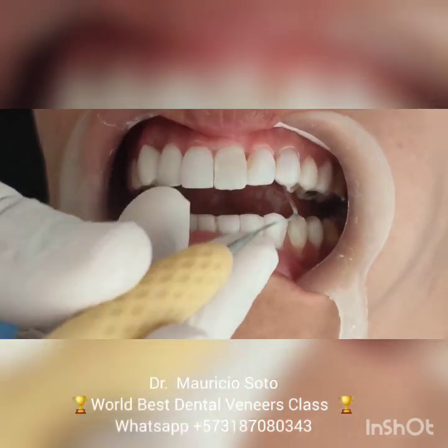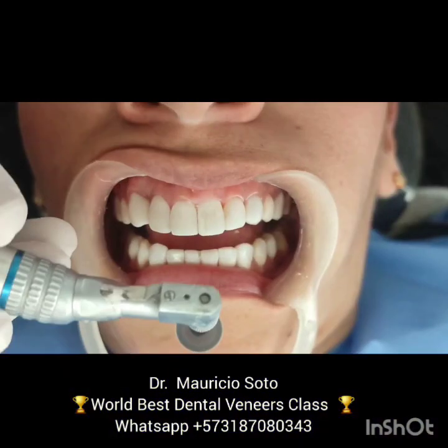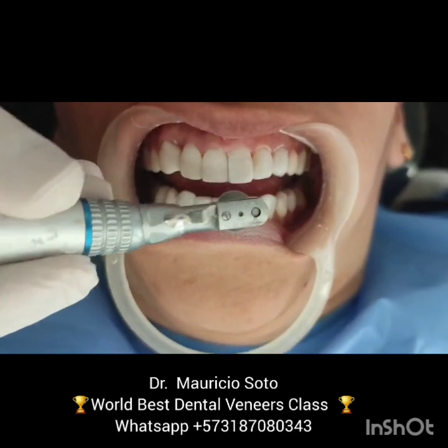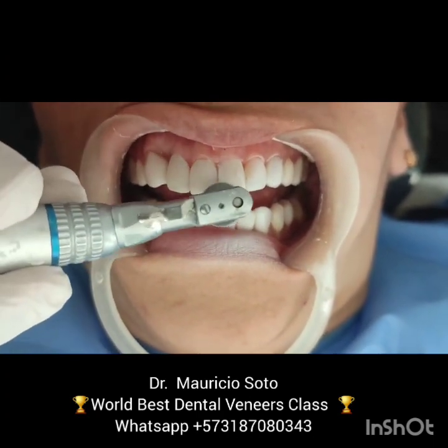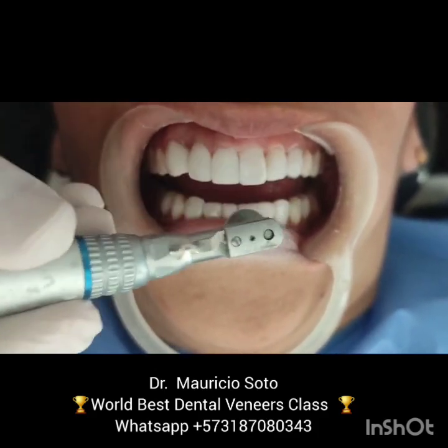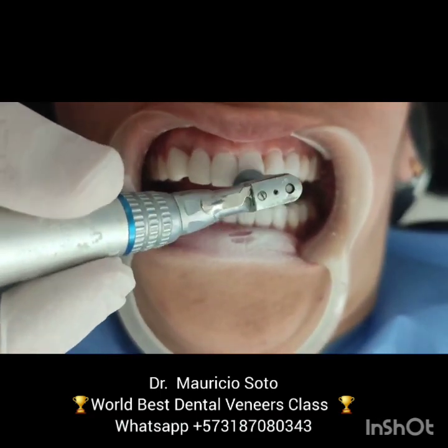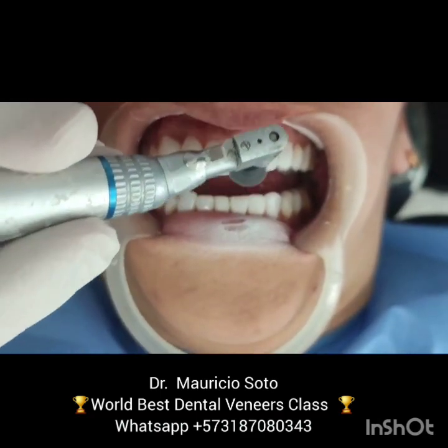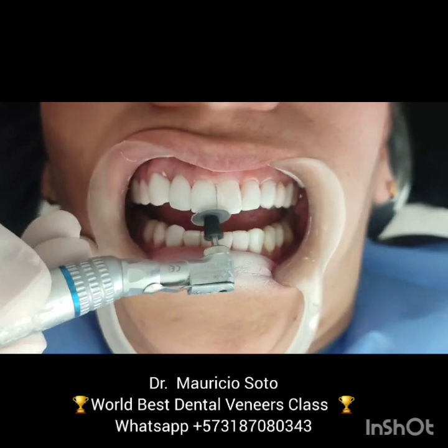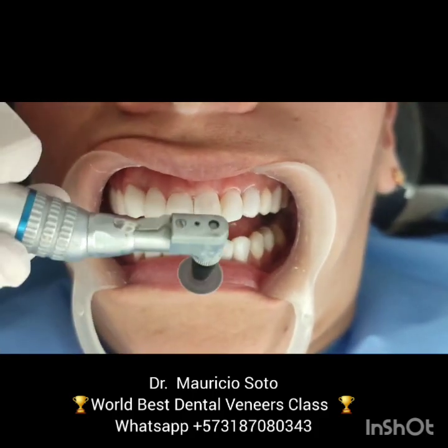Take your time and create a perfect shape. After finishing, harden the composite with the curing light for 40 seconds. After building your veneer with the composite, you start the finishing procedure. The finishing begins with a black Shofu Super Snap disk to adjust the size and shape of the veneer.